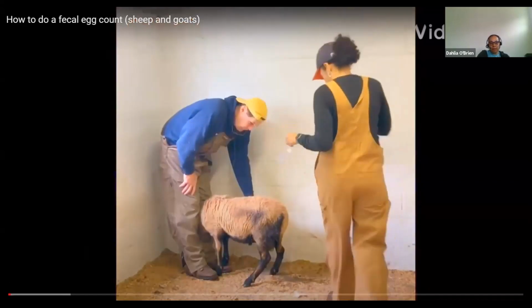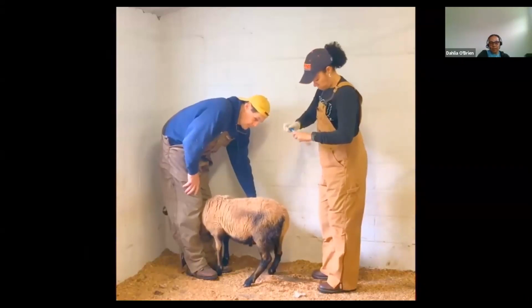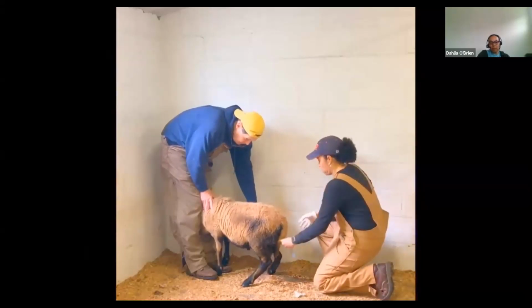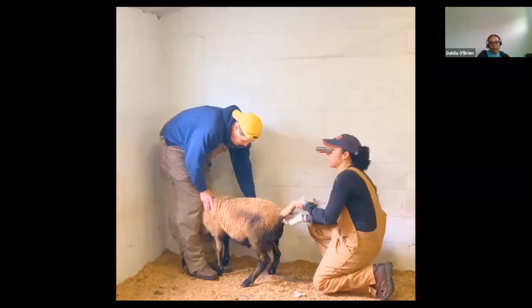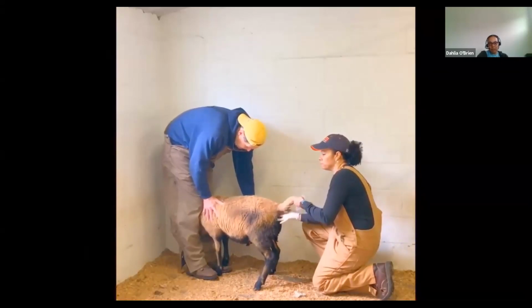Okay, so there I am. I have my labeled bag. I have my lube in my pocket, and my colleague, Dr. Stefan Willius, is assisting by restraining the animal for me. So you'll need someone or some method of restraining the animal to take a fecal sample. No animal likes giving a fecal sample, so you'll need some way of doing that. As I mentioned, you'd need lubrication as well.